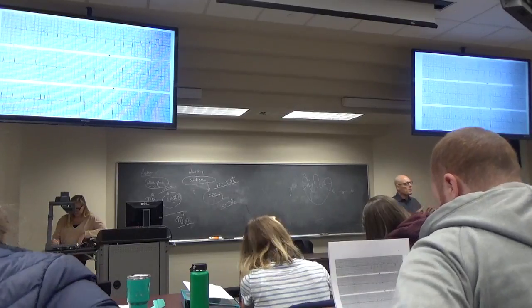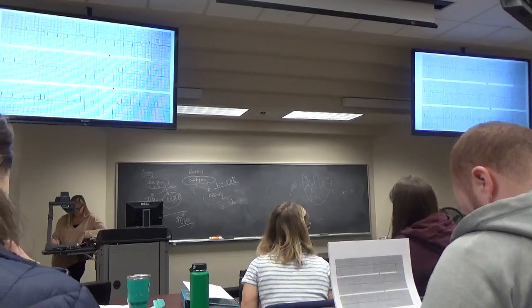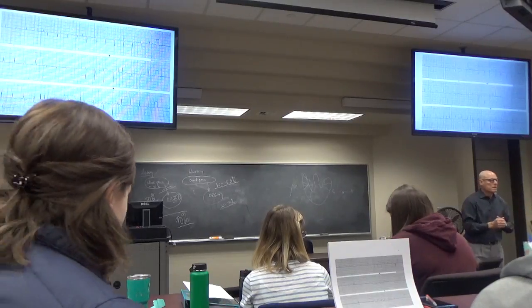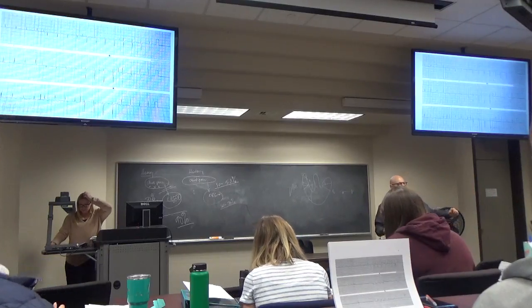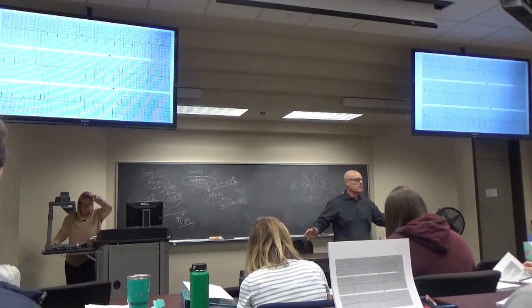Okay, so let's remember what we're doing. We're interpreting a flat piece of paper, and the T waves flip. We don't know anything about the patient because we're not in the room. We're sitting at a heart station somewhere, or in a PA EKG interpretation course. We don't know anything about the patient.